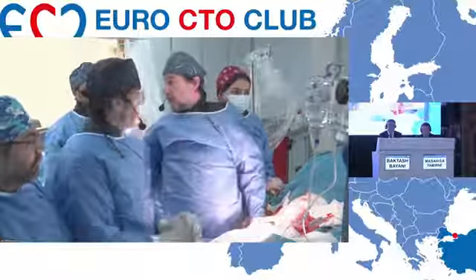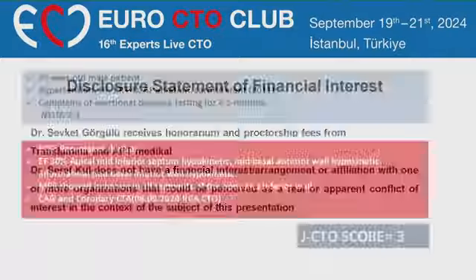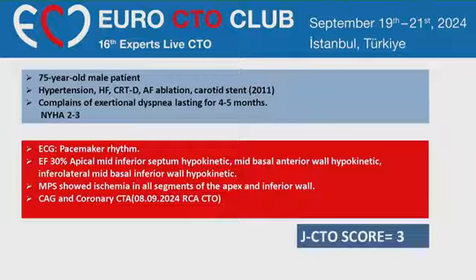Okay, please present the case. Hi, welcome back. I'm Dr. Güneş. I'm a cardiology resident at Medeniyet University, Süleyman Yalçın City Hospital. Our first case, the patient is a 75 year old male with a medical history of hypertension, heart failure, CRTD, atrial fibrillation ablation, and a carotid stent performed in 2011.